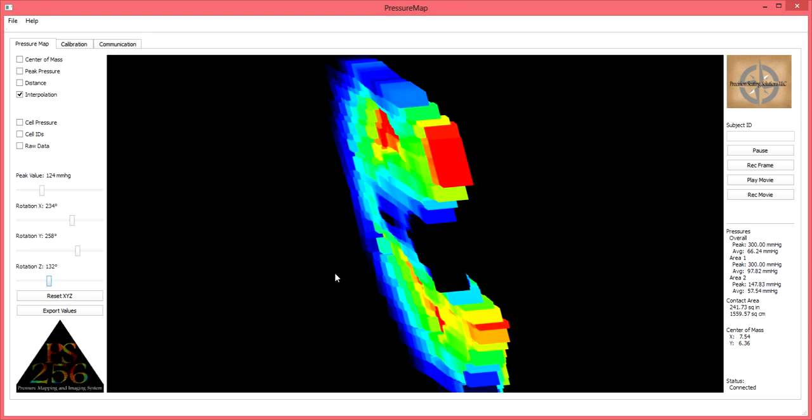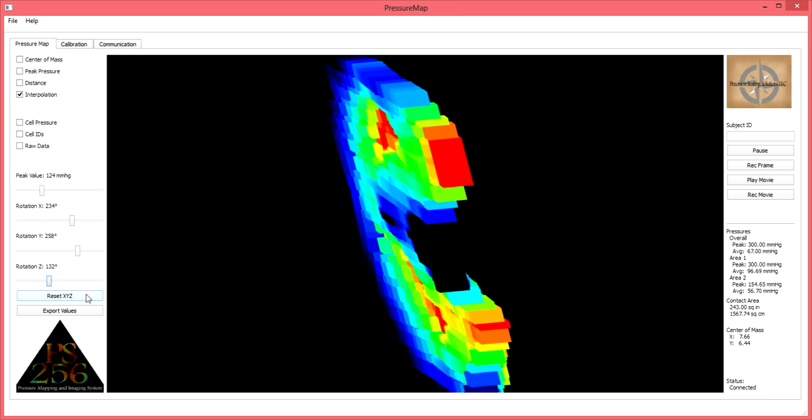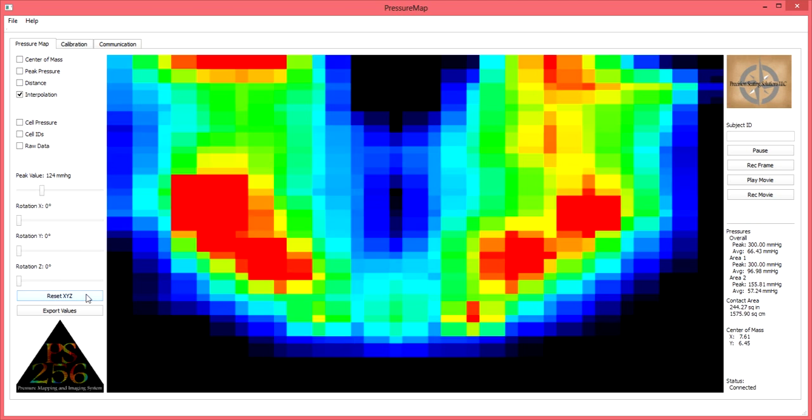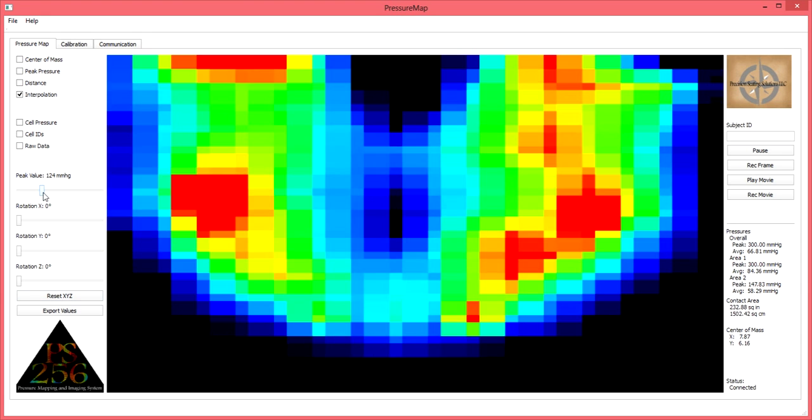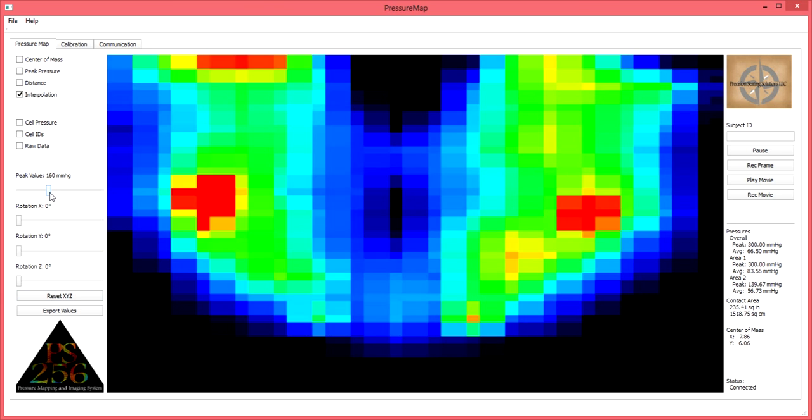To reset the rotational feature back to the original display, click on the Reset XYZ button in the lower left-hand corner of the software screen. As you can see, the rotational view will return back to neutral when this is selected.